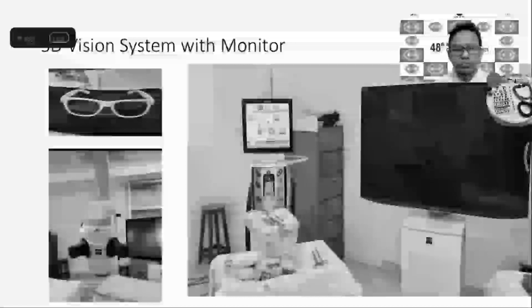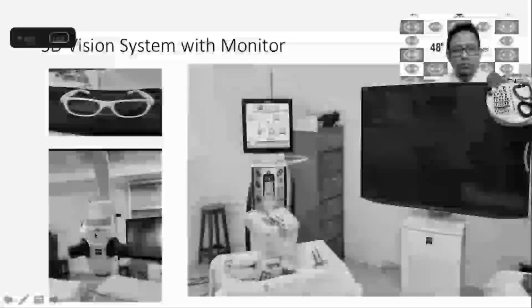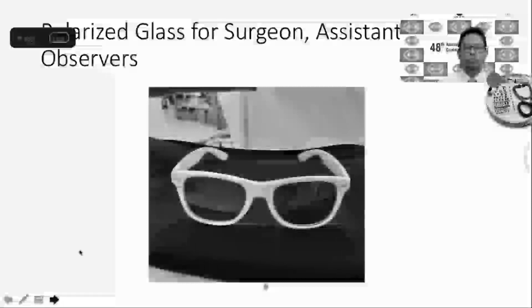This is the 3D vision system with monitor we have at Bangladesh Eye Hospital, Dhanmondi. We have been practicing it for a couple of months, and you can see here the monitor and the phaco machine. On the left hand side, you can see the glasses, the polarized glasses, and here the microscope. I will later show you that the eyepiece is not here. These polarized glasses can be used by the surgeon, assistants, observers and trainee doctors. Even the attendants of the patients, if they want to see, can attend the OR and see this OT in a 3-dimensional view.